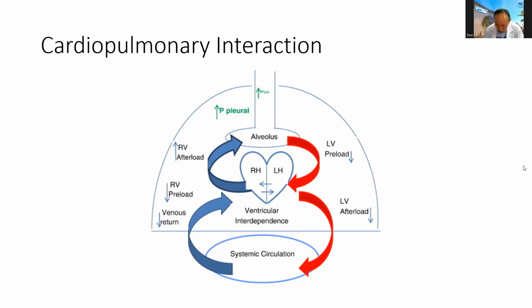Like I was trying to explain, usually we say for a normal patient you want a 1:2 ratio, 1 inspiration to 2 expiration. But to be able to achieve that 1:2 ratio may not be that easy. So looking at the amount of tidal volume you want, because on some ventilators you adjust the IE ratio to be able to get the tidal volume. But for me, as long as we do not compromise too much of the expiratory time, I am okay to increase inspiratory time, as long as I achieve my tidal volume.